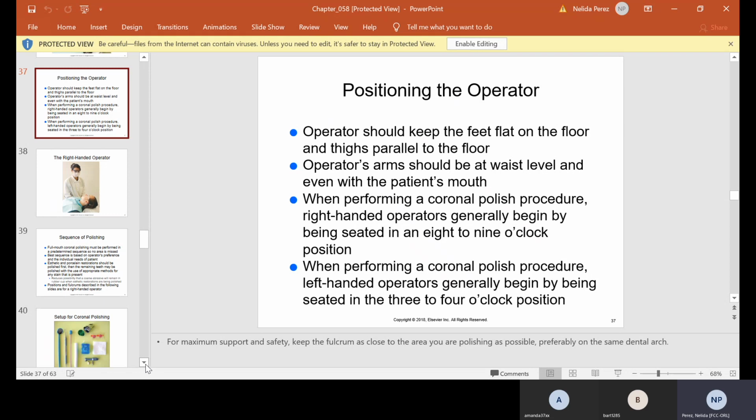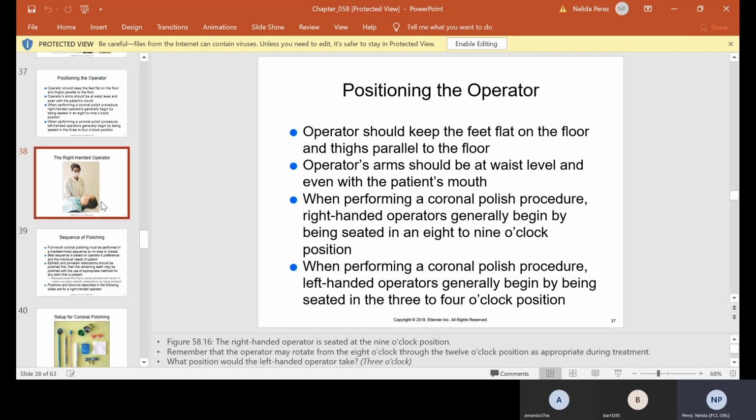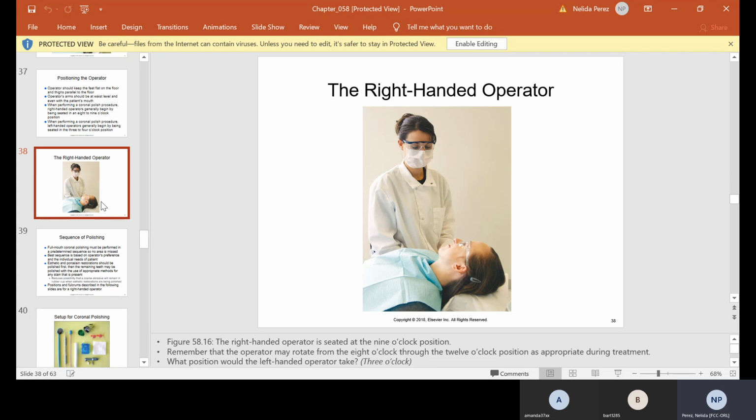Operator arms should be at waist level and even with the patient's mouth. When performing a coronal polish procedure, right-handed operators generally begin by being seated in an 8 to 9 o'clock position. And when performing a coronal polish procedure, left-handed operators generally begin by being seated in the 3 to 4 o'clock position. Most of the time, regardless if you're right or left-handed, depending on how the operatory was made, we usually work on the right side of the patient.